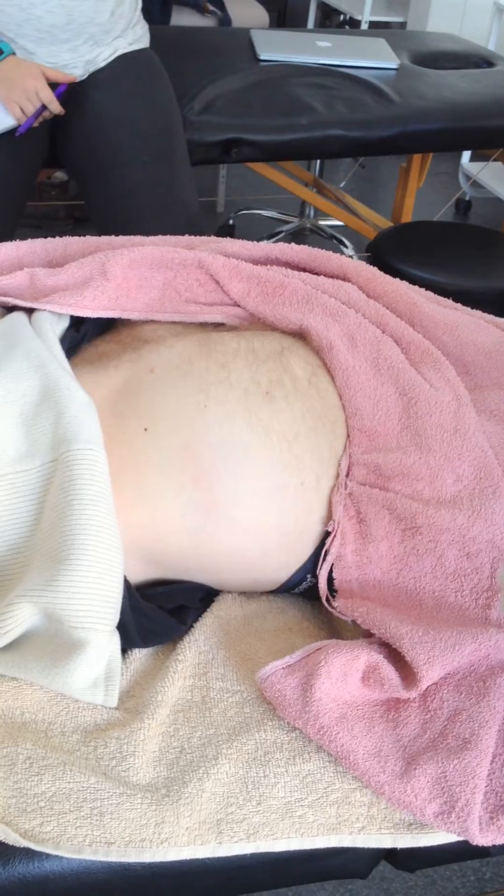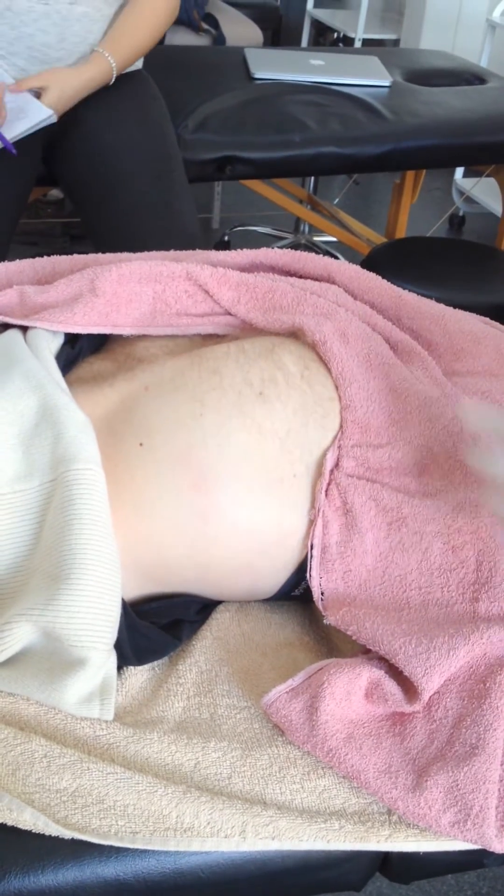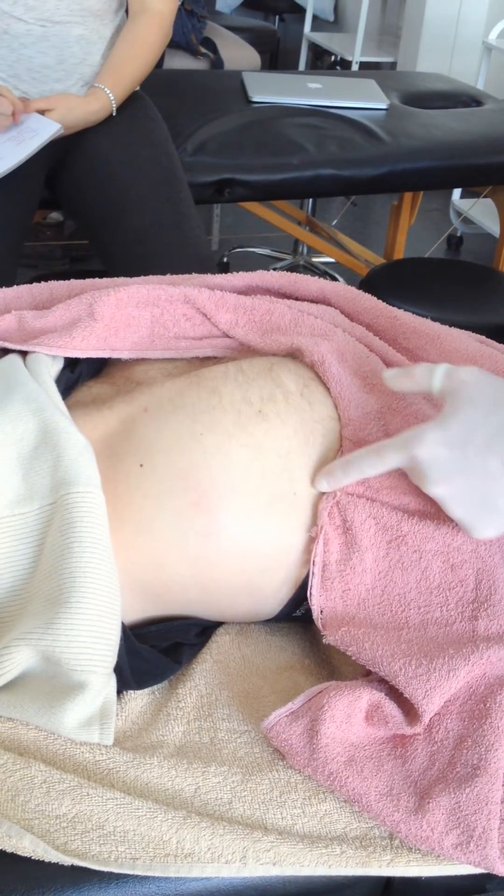Hip extension will bring it up. You can see the border of it there coming up through here.